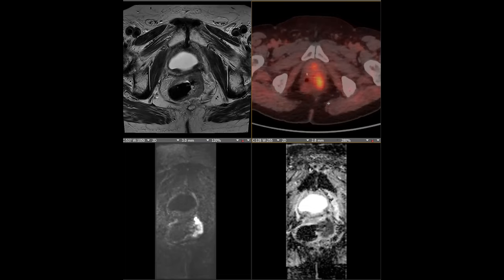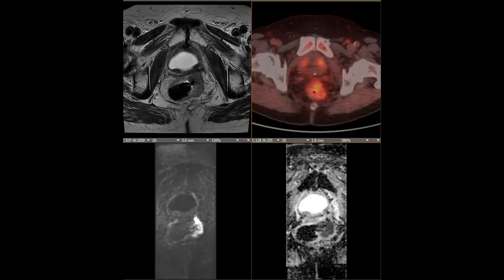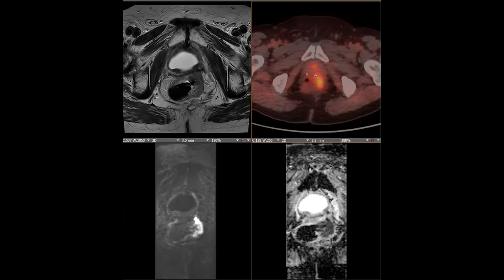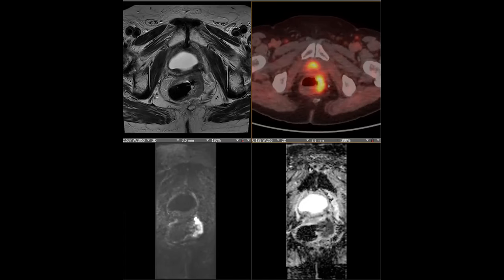Yeah. So with fluciclovine, they don't like it as much as carbon 11 choline. This case isn't the best example of it, but theoretically the urinary bladder uptake is less. And they're essentially equivalent though. The mechanism is a little different, but the sensitivity is supposed to be the same. Fluciclovine is just an L-leucine analog, so it's taken up like any amino acid would be.